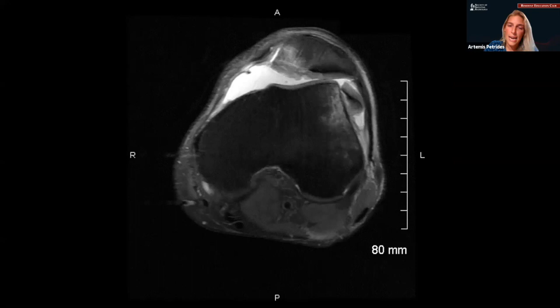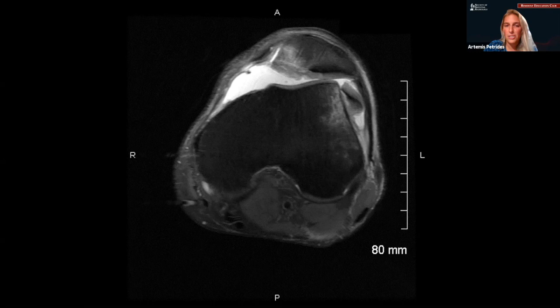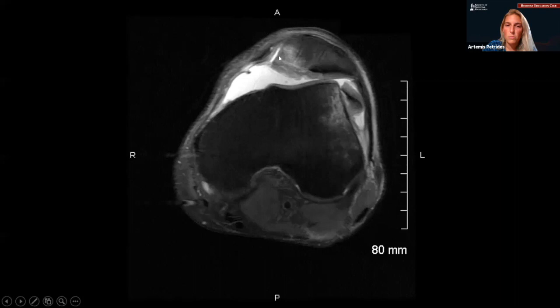Our first case: all cases will start as axial imaging, most of them PD fat saturated, and for clinical history, all cases will present with pain. In this first case, after looking at it for a few seconds, you can see there are obvious abnormalities. We can see a joint effusion, and if we continue to look at abnormal edema signal, there is signal in the lateral femoral condyle and some abnormal signal in the medial patella, consistent with contusions — what we often refer to as kissing contusions.